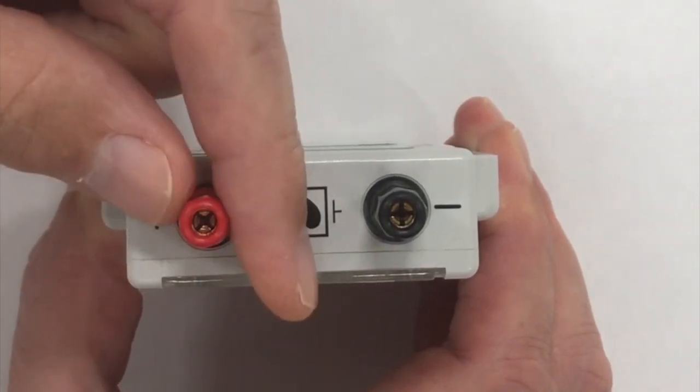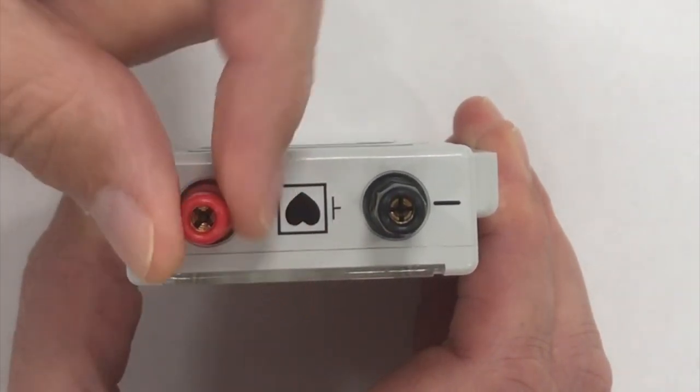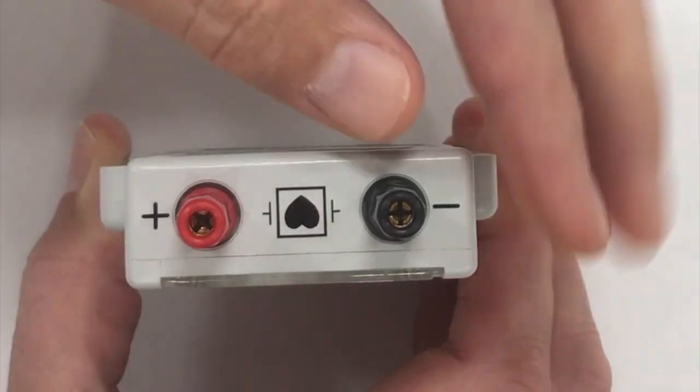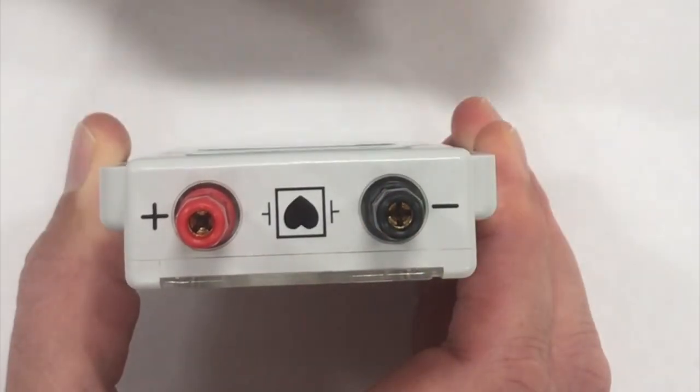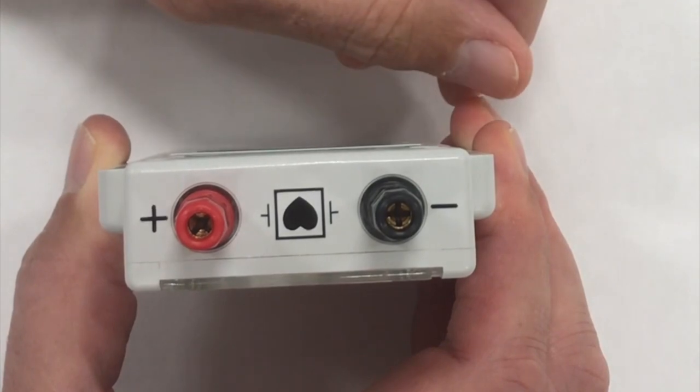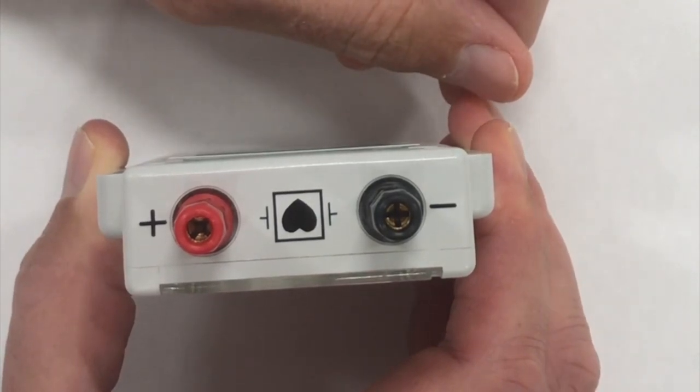Rotating them to the right tightens, and rotating them to the left loosens. And we have this plumber's acronym called Righty Tighty, Lefty Loosey. Left to loosen, right to tighten.